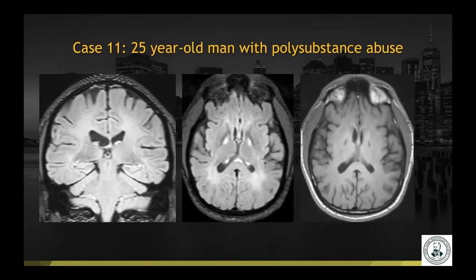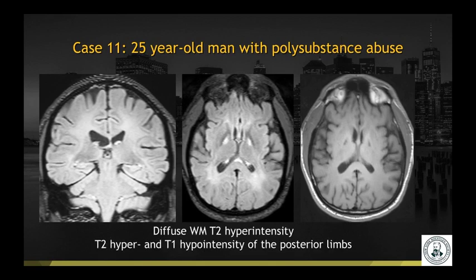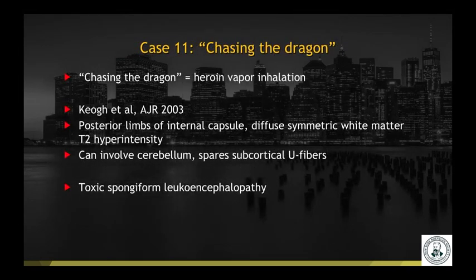Case number eleven: a 25-year-old man with polysubstance abuse. Diffuse white matter T2 hyperintensity, very ill-defined, as well as T2 hyperintensity and T1 hypointensity of the posterior limbs of the internal capsules. This was a case of chasing the dragon, or inhalation of heroin vapor. It has this typical distribution with periventricular symmetric, ill-defined, diffuse white matter abnormality with sparing of the subcortical U-fibers.